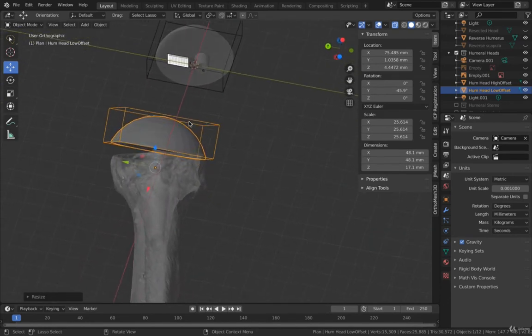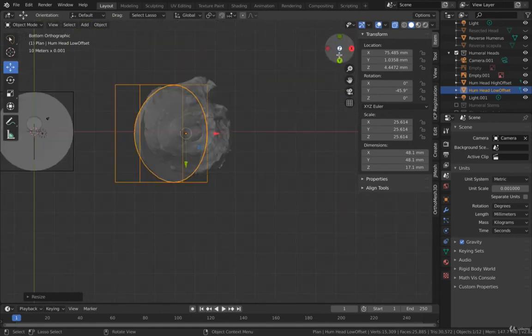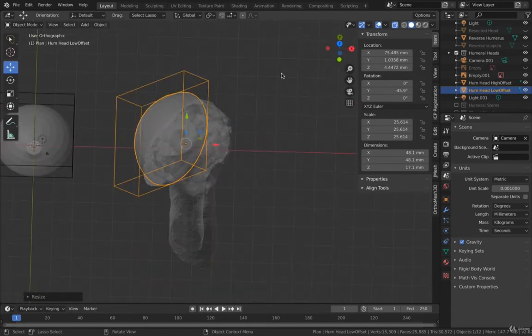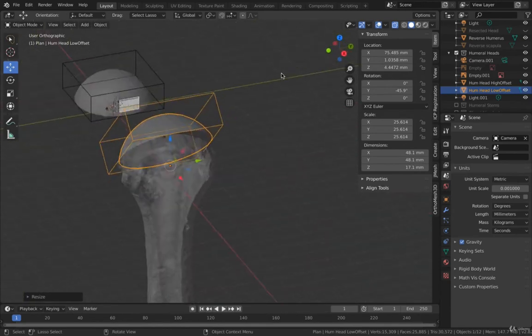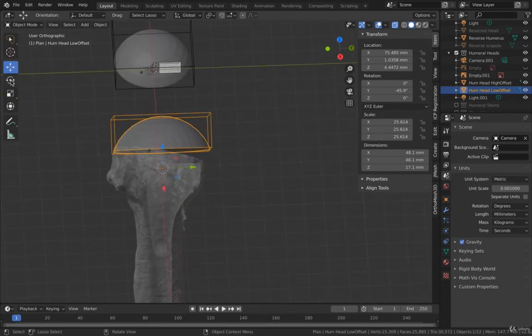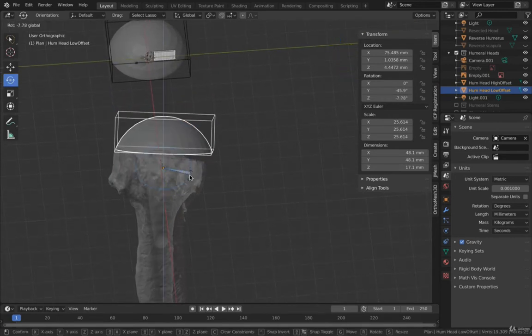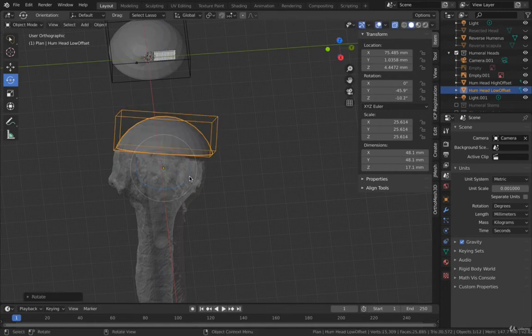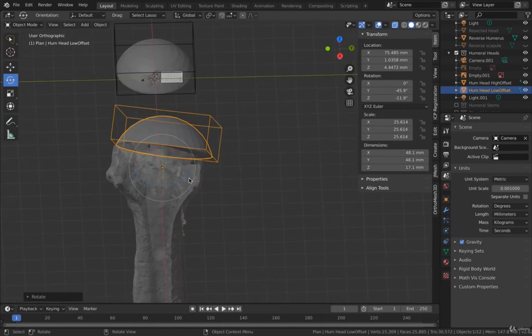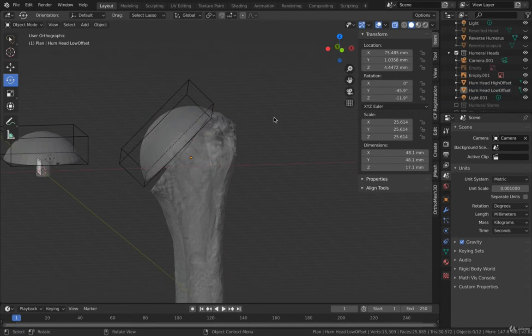Now if we look this way, we have to tilt our stem some because it's not in the right position. The way we would do this, we just need to rotate it to the appropriate position, which is right in there. I'm going to click on this and then press this key for rotation, and then I'm going to try to tilt it a little bit this way, so we have a good fit with our plane of resection. And this is now the humeral side.